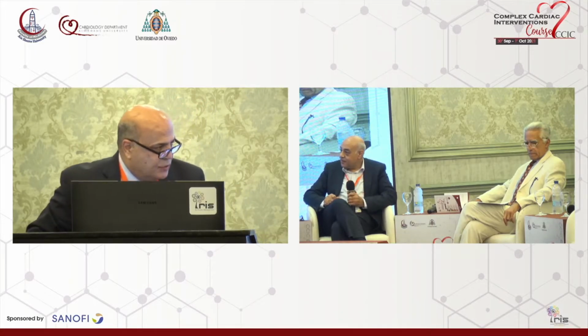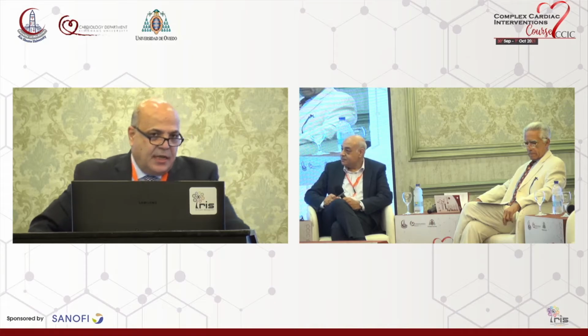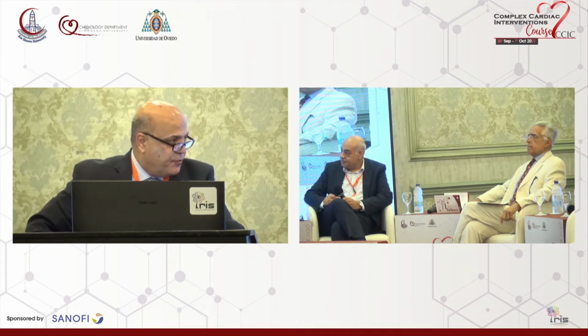Thank you, Ahmed, for these two important questions. First, if my decision from the start is to do a left main intervention, I will definitely go for the right coronary first, then do the left main intervention. But my decision was based on the FFR, that I could go for the circumflex obtuse marginal, then the LAD diagonal, and there was no plan to do a left main intervention.